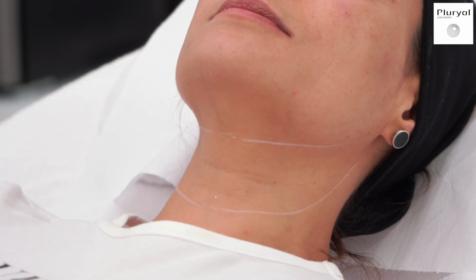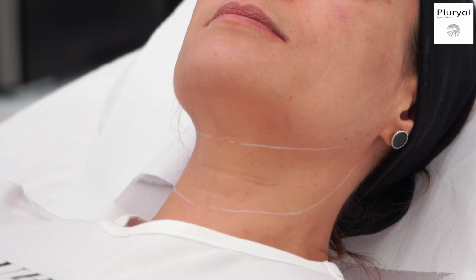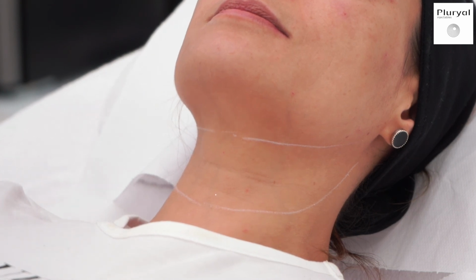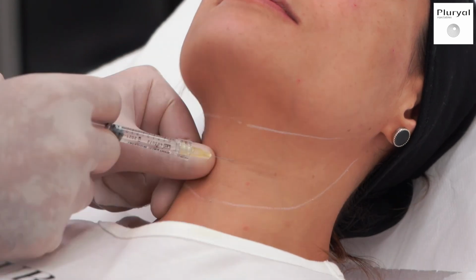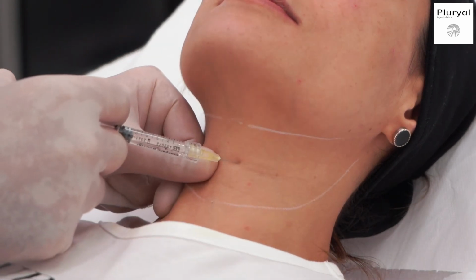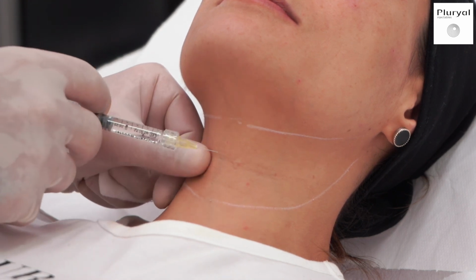You can use either a needle or a cannula, but if you want to use a cannula, you really have to be very superficial. So you do a small injection, and you have to see the papule.